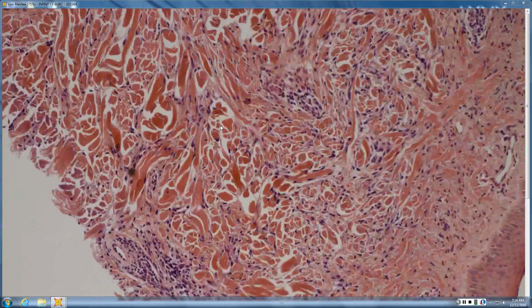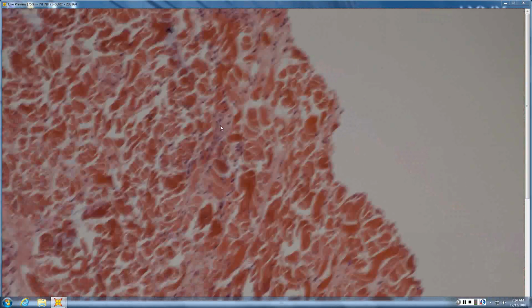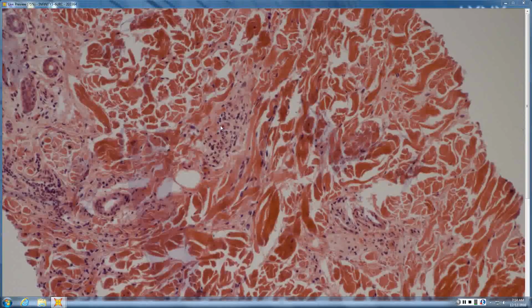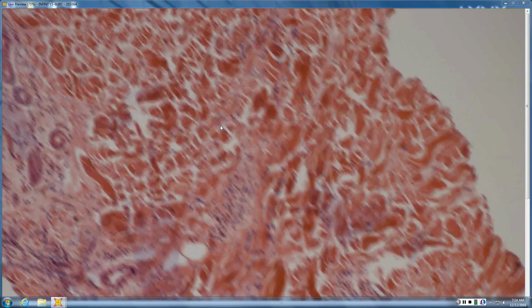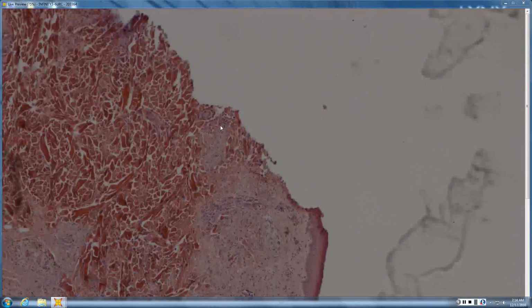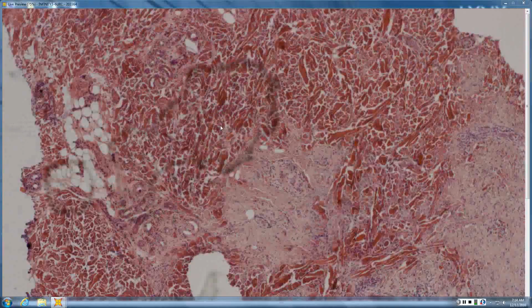Is it also like scleredema, which starts at the top and goes down? I don't know, though this example fits with that. Just know that histologically, without any history, they're both stuck in your differential. So, any questions about scleredema?